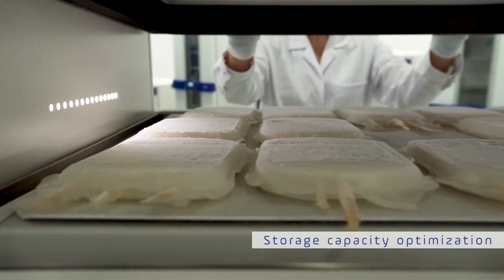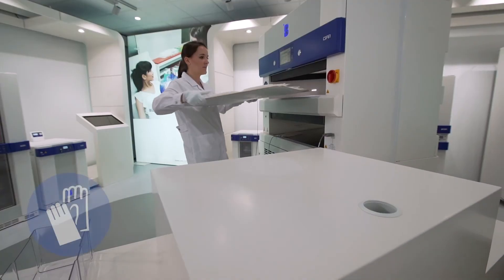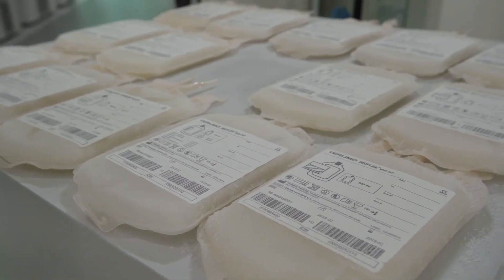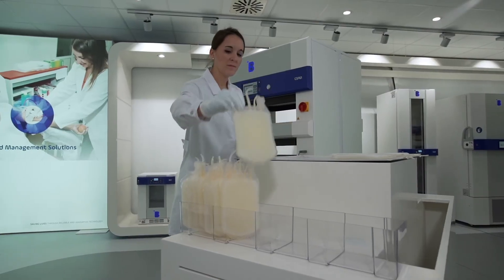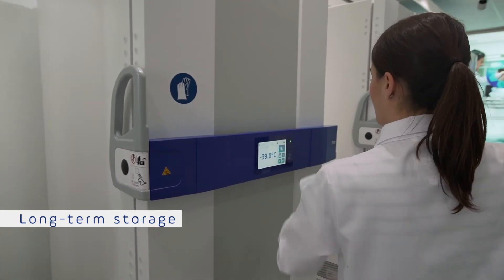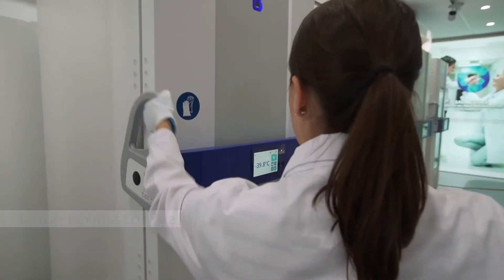Your bags are now evenly frozen and super flat. The accurate temperature control has avoided all freezing and wastage of plasma. Store your bags in a reliable plasma storage freezer free of frost until required for transfusion.